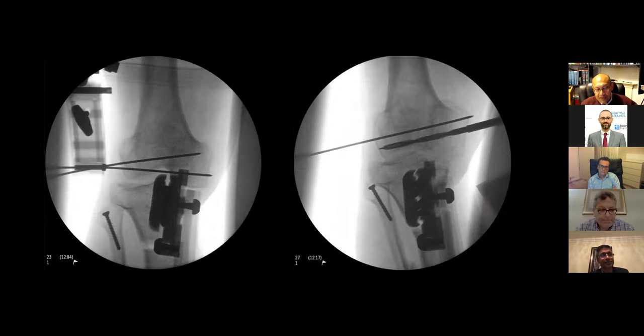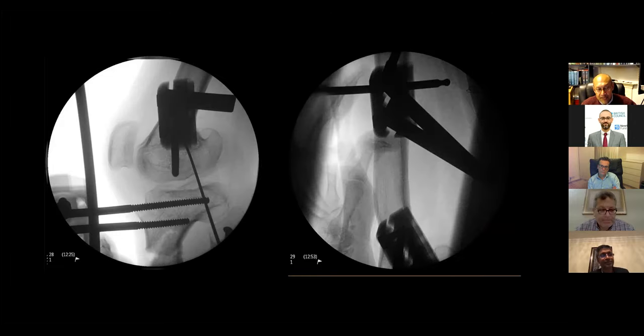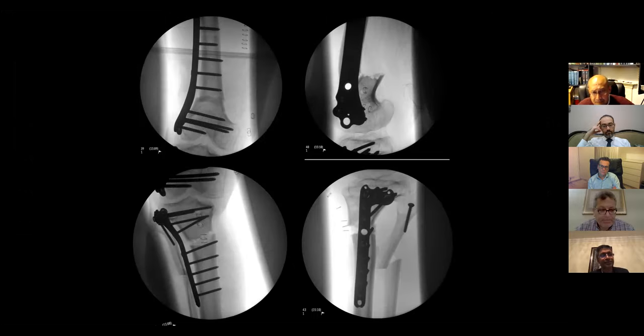These are the reference pins, the 10 degree guide that Professor Sharma mentioned earlier, so as to correct the femoral deformity, together with the pins placed to also correct the procurvatum or flexion deformity of the femoral condyles. Final check after femoral and tibial osteotomies: intraoperative check of the mechanical axis. The mechanical axis looks to be close enough to the center of the knee joint, so I accepted this before substituting with internal fixation. So you will see here in the femur, virtually 100% translation.